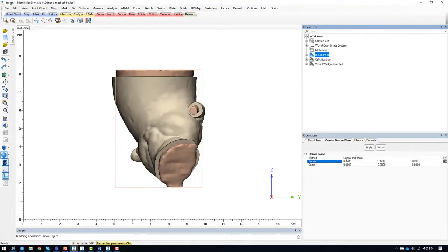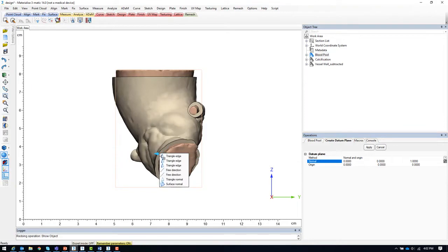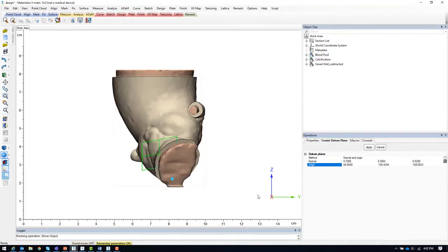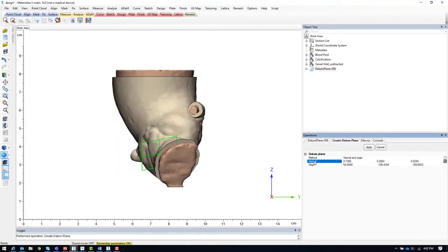We will use the normal and origin method and select the triangle normal on the cut space of the vessel wall opening. Once we have defined one datum plane, we can go ahead and select additional as needed.